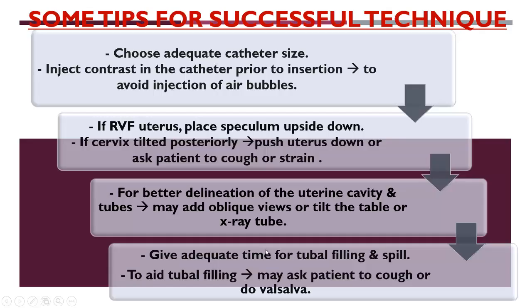If the tubes are not appearing the first time, please give time and start to infuse very, very slowly in order that the tube can open. To aid tubal filling, we may ask the patient to cough or do Valsalva.